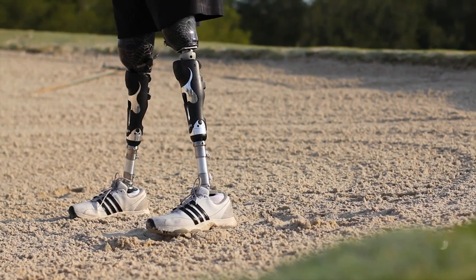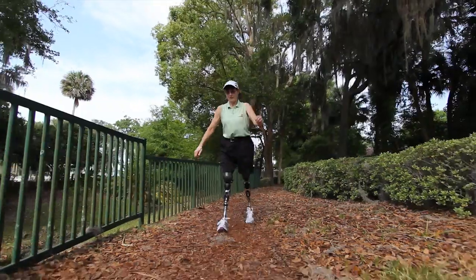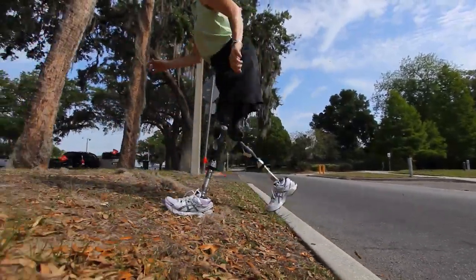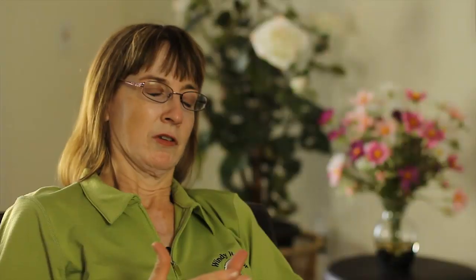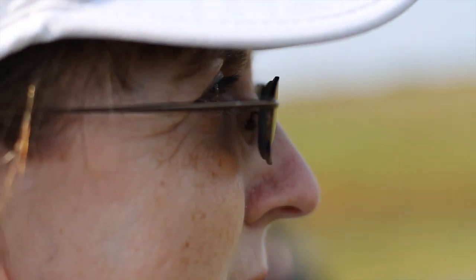They also have multi-axial movement, so I can actually literally do a split sideways, and when you're on uneven terrain, I always feel like my feet are flat on the ground. Part of being able to do what I can do is having some of the greatest components around. I'm very blessed to say that I'm fortunate to have what I would consider top-of-line technology.